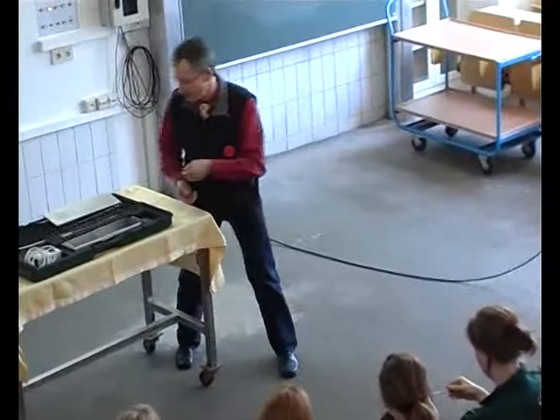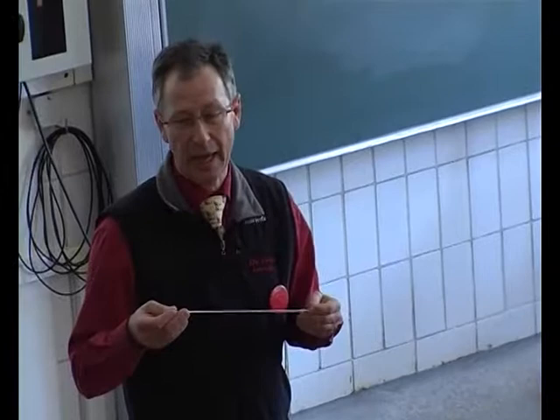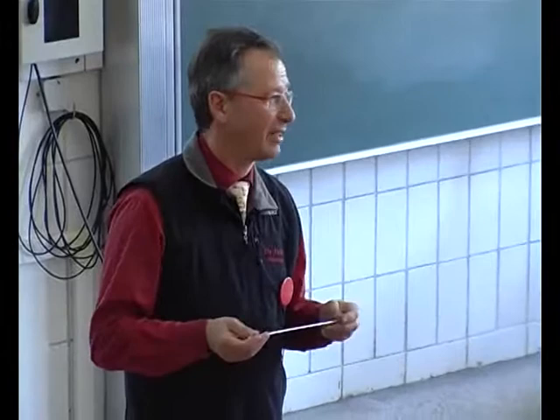There is a puncture needle in it. If the abomasum is too full in an abomasal displacement, you use it. But as you have seen, Dr. Janowitz did puncture the abomasum automatically from the beginning so that the abomasum is not too full. So this is only used seldom.